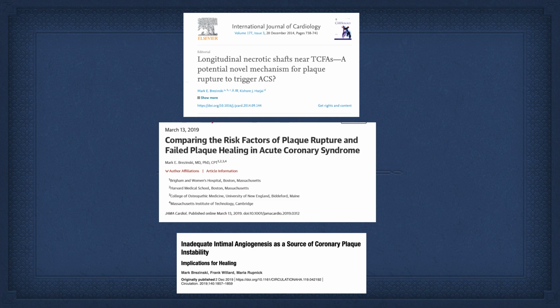2014, where we started to think, the question had been asked, it wasn't only 15% of thin caps lead to ACS, and a majority of them from the PROSPECT study actually just get thicker.